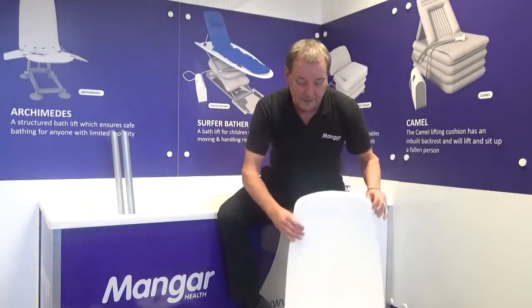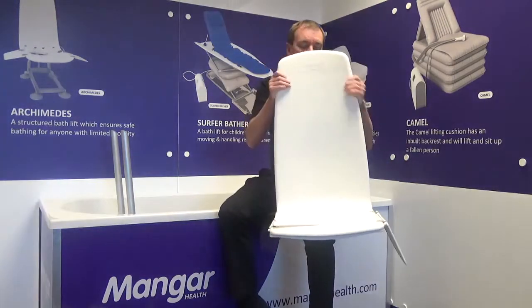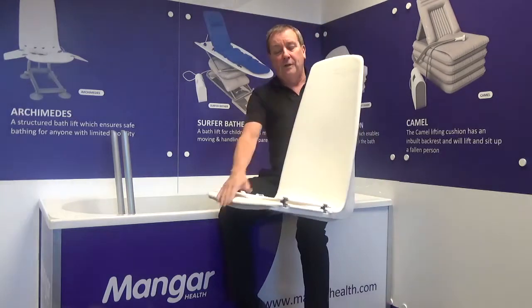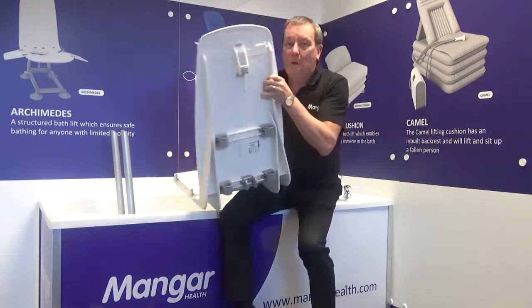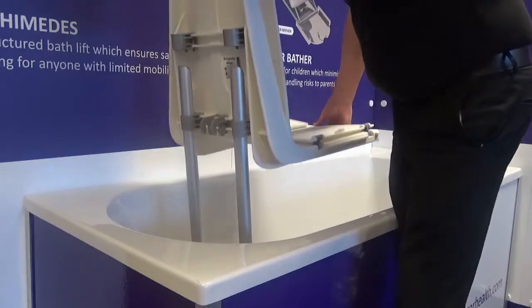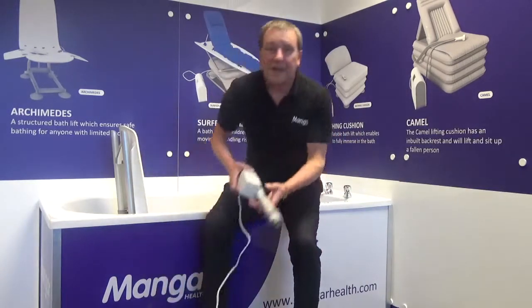Next thing to put into place is the seat section. Seat section has 2 flaps, and this actually is the heaviest bit. We're only talking here about 5 kilos. But as you can see, I've got these hooks on the back, which quite simply go over my rails. It drops into place.